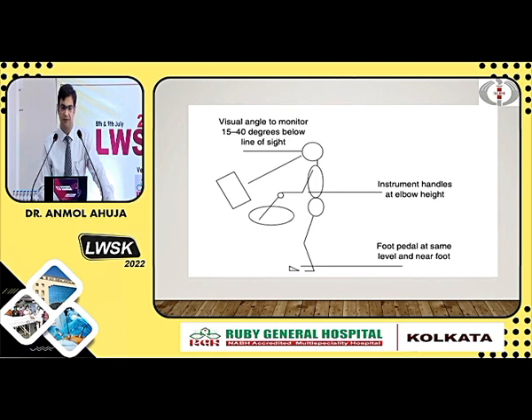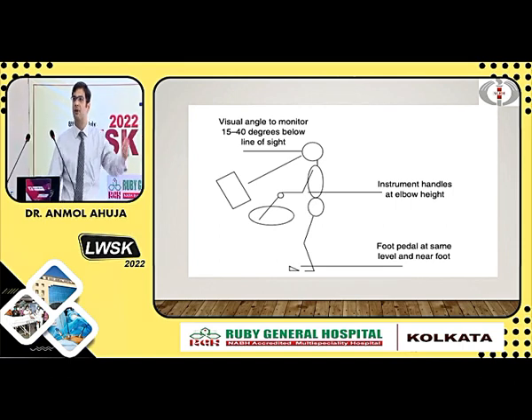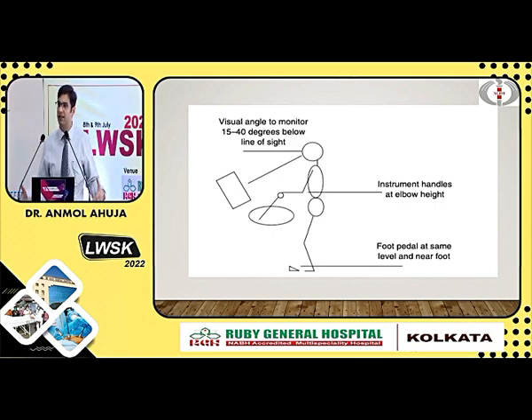This is the monitor 15 to 40 degrees down, and the foot pedal has to be near. It should not be that the foot pedal is somewhere else and it won't be possible for you to perform a surgery like that, and it happens usually. So make time, ask your assistants to place everything near you so that it's easy to follow.